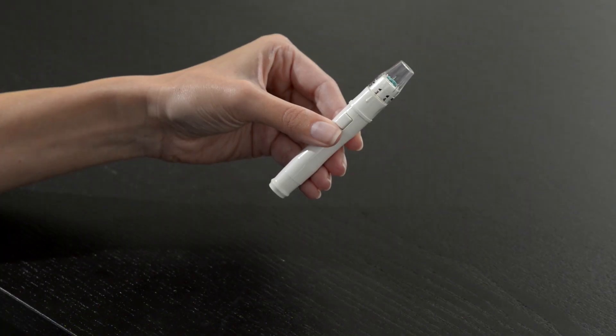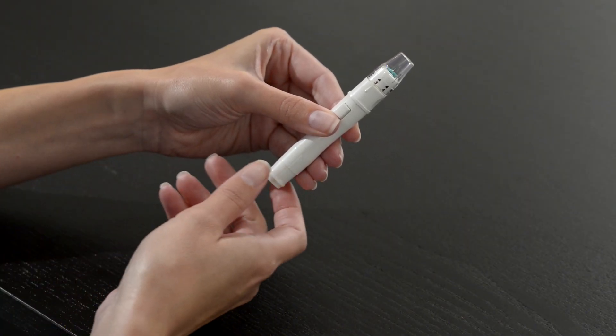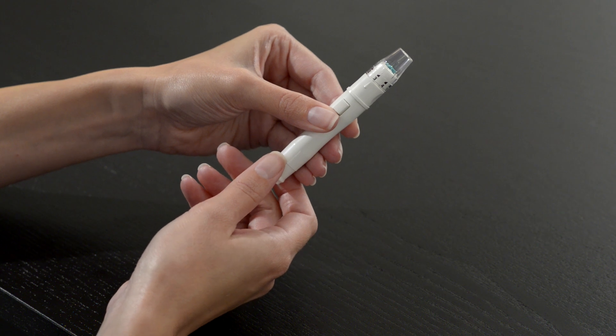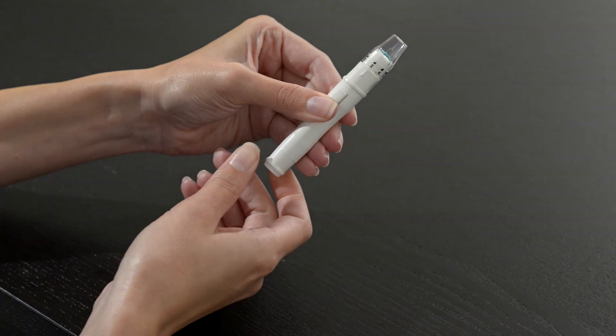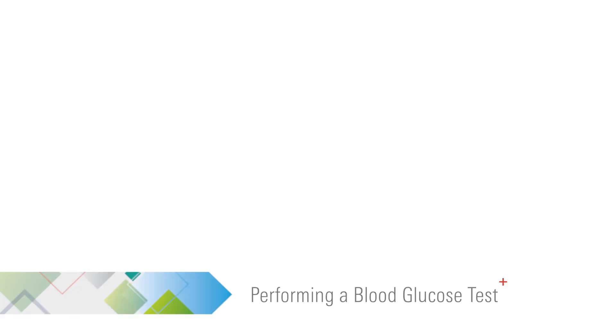Cock the lancing device by holding the body in one hand and pulling on the sleeve with the other hand until the device clicks. You are now ready to perform a blood glucose test.